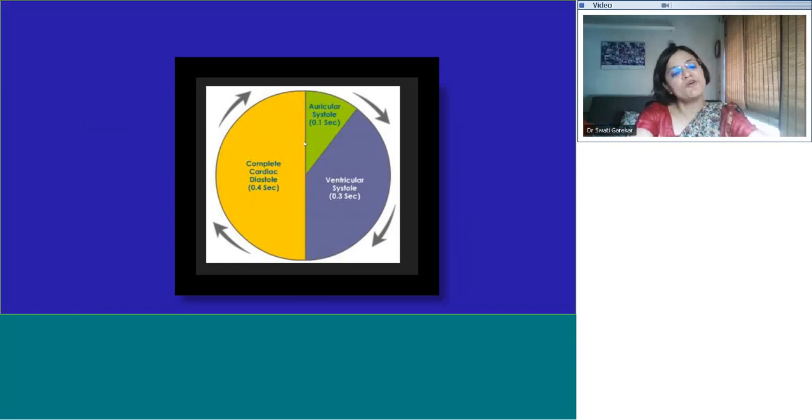So that's one way of answering that pre-test question: if you look at ventricular systole and diastole, then the ratio is 0.3 to 0.5, or 3:5. But if you look at complete cardiac diastole, that only lasts for 0.4 seconds, because you've got the atrial systole coming here for 0.1. So you have a systolic-diastolic ratio actually being 1:1 right over here. 0.4 here, 0.4 here.